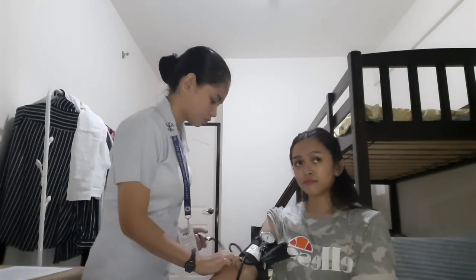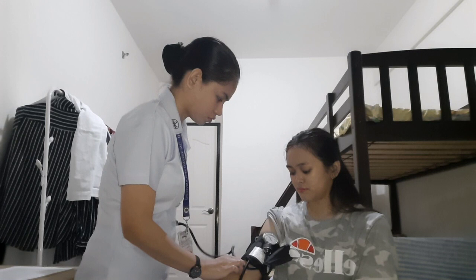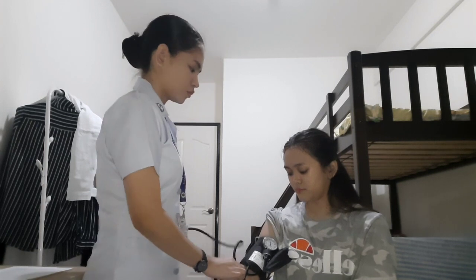So now, I will use my two fingertips to feel a strong pulsation on the antecubital space. Accurate blood pressure reading is possible when the stethoscope is directly over the artery. And then deflate the cuff. So I have already taken the estimated systolic pressure, which is 110 millimeters of mercury. For the actual taking of BP, I'm going to inflate the cuff about 30 millimeters of mercury higher than the estimated systolic.